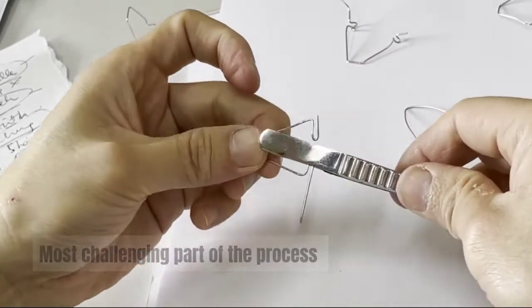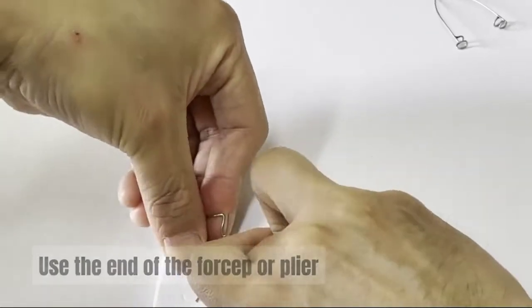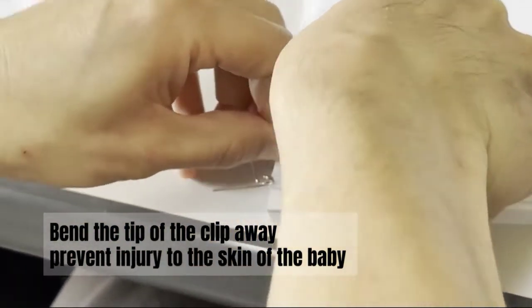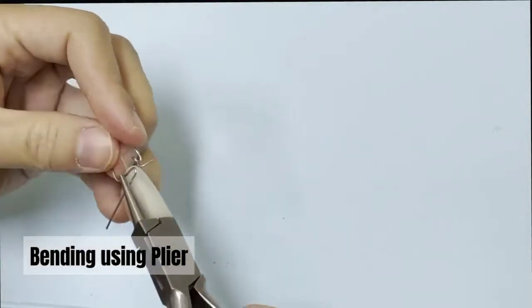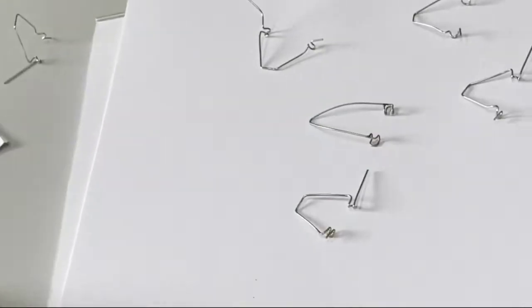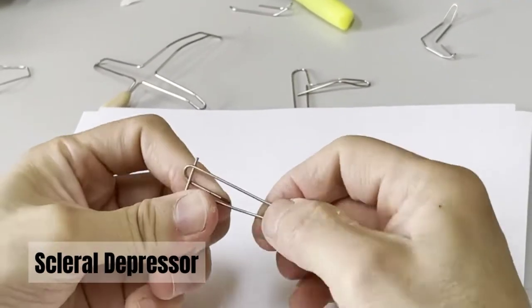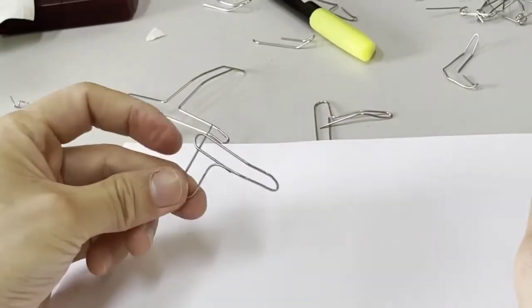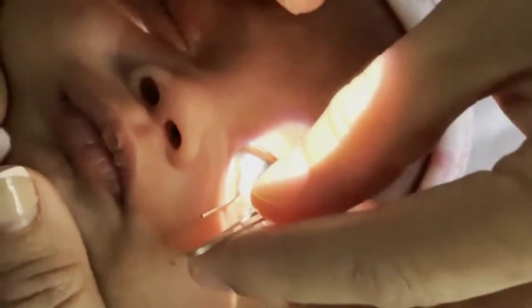The most challenging part of the process is probably forming the speculum blade portion. You can use the end of the forcep or plier for the job. Bend the tip of the clip away to prevent injury to the skin of the baby. Now let me show you how to DIY a scleral depressor. Remember to make a smaller arch at the tip. Here is a demonstration of ROP exam using the DIY baby speculum and scleral depressor.